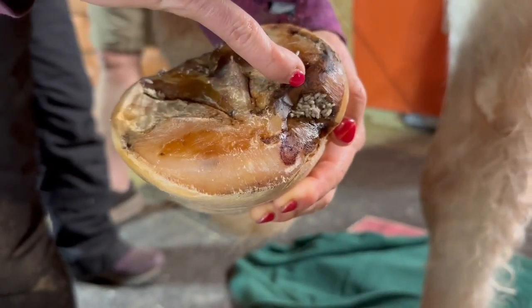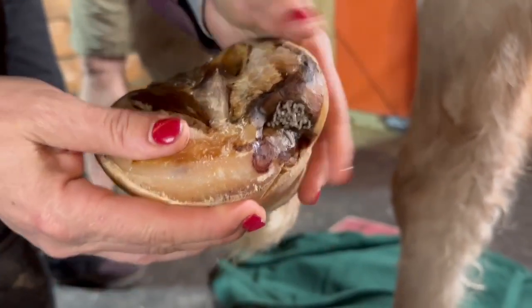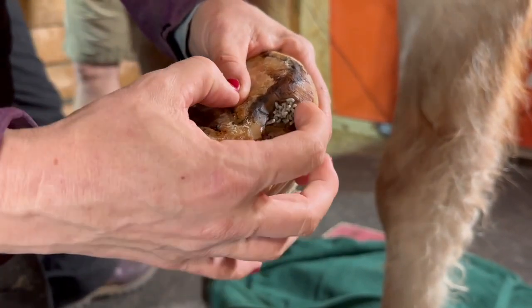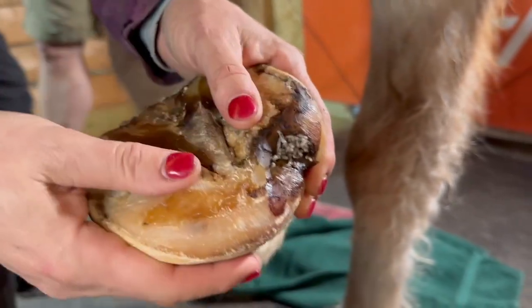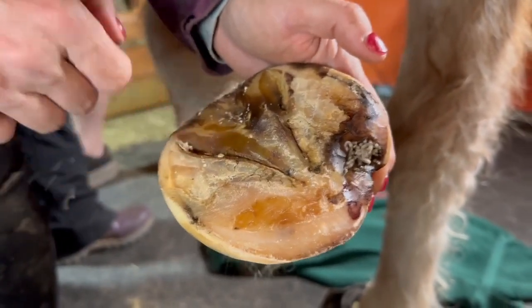So they're all way up in there. So then we'll flush them out. It's appropriate to remove them today, because the stripe is all the way down their back, even though they're a little small. That just tells me that they couldn't access as much, but look how far in there they are. They're probably all eating up in here, and that's what they need to do — because we don't want to debride that far, because it will destabilize our capsule.